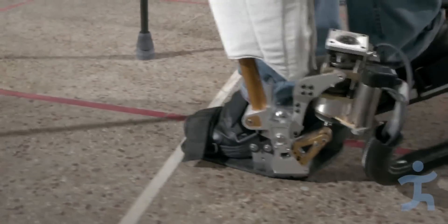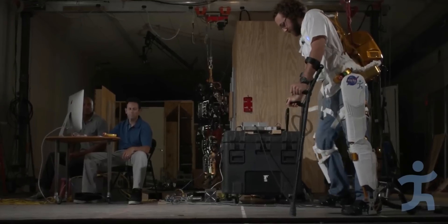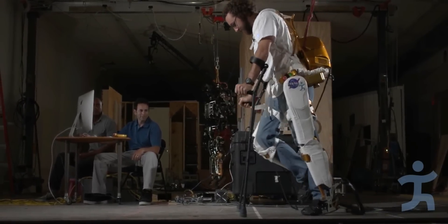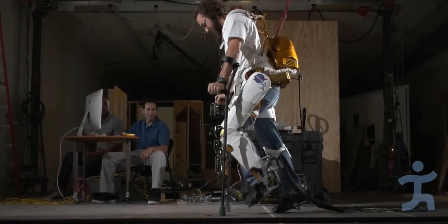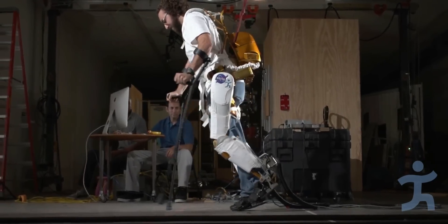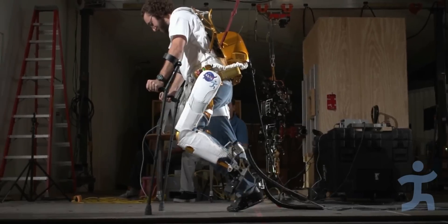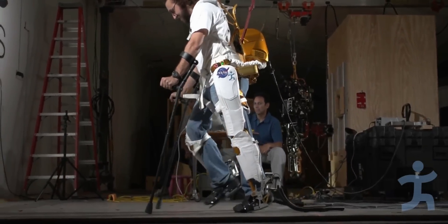Our first test with the powered ankle and X-1 combination was with an able-bodied person, and we're evaluating our software and hardware to see that they all work in conjunction with each other. The testing was not looking for quantifiable data — it was more about making sure that software and hardware work together and asking the user how it felt having the assistance of a powered ankle.